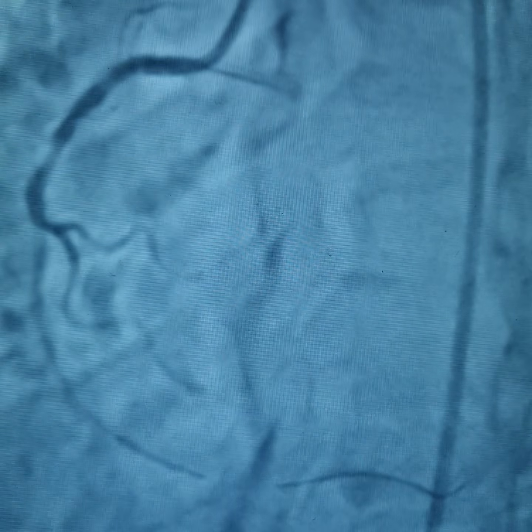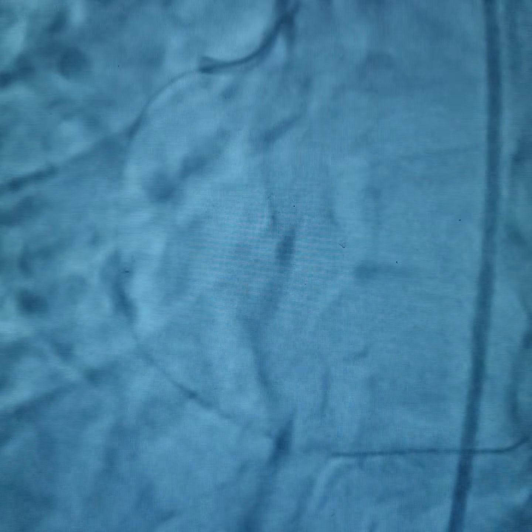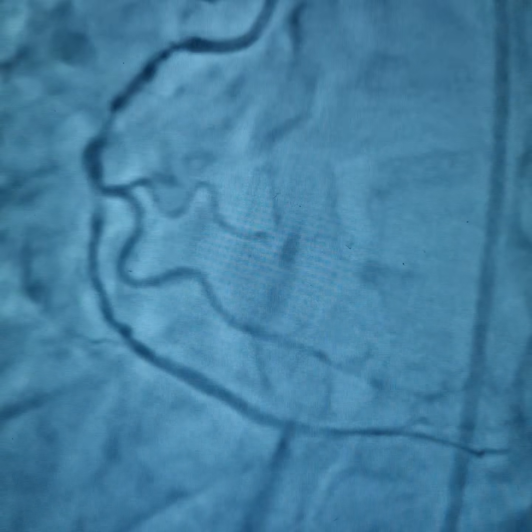So we used a 2.75 by 12 mm stent right here, and we've expanded that 2.75 mm stent, and we're post dilating it with the stent balloon only because it's a distal RCA. It's all right, and we've inflated the post dilatation to about 12 atmospheres pressure. You can see the distal stent has expanded well, and we have got no complaints here.